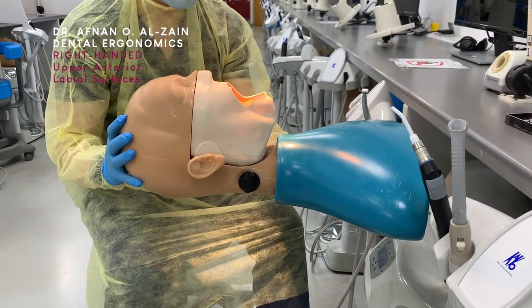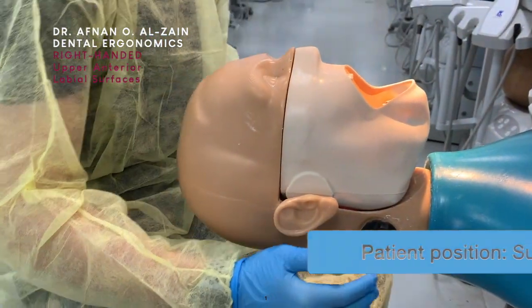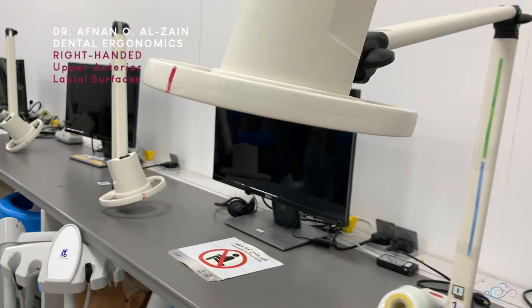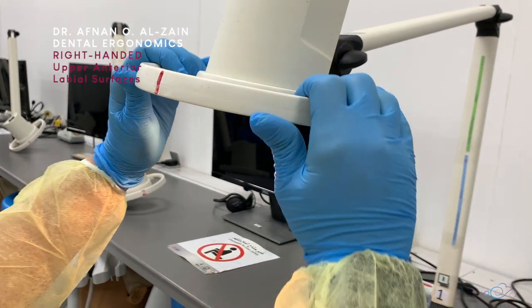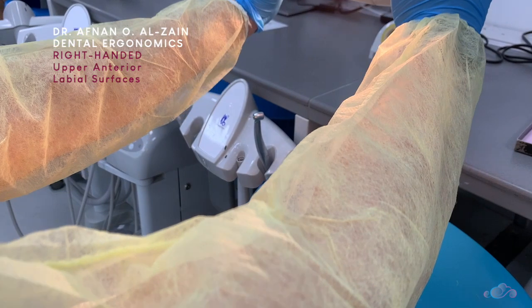For working on the labial surfaces of the upper anterior teeth, to work on maxillary teeth, you're going to place the patient or the dummy head in a supine position. Make sure that the level of the patient's head is at the level of your elbow. Then you're going to readjust the light so you can see properly when working on the upper teeth.